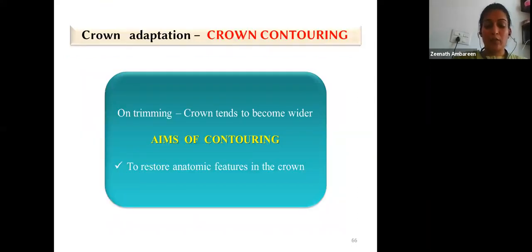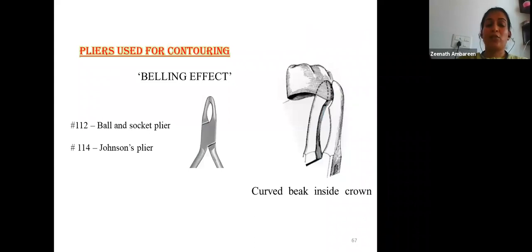After tooth preparation and initial crown selection, the crown is checked for blanching, trimmed, polished, and placed again. The next step is contouring, because trimming causes the crown to become wider. Contouring restores the anatomic features using ball-and-socket pliers or Johnson's contouring pliers. Contouring is done in the middle third of the crown — the bulbous portion of the plier is passed around the circumference to create a belling effect that simulates natural tooth contours. After trimming, the proximal portion appears flattened; contouring restores it to simulate the natural tooth.